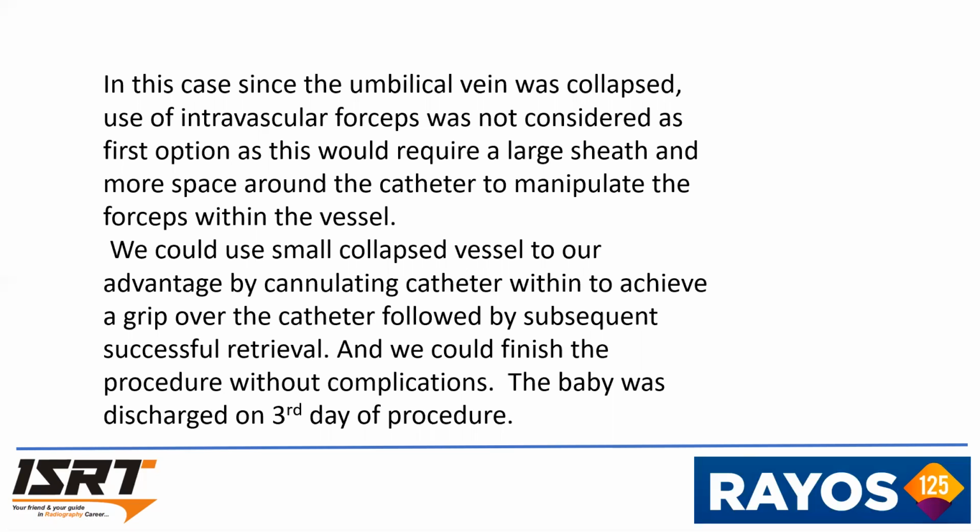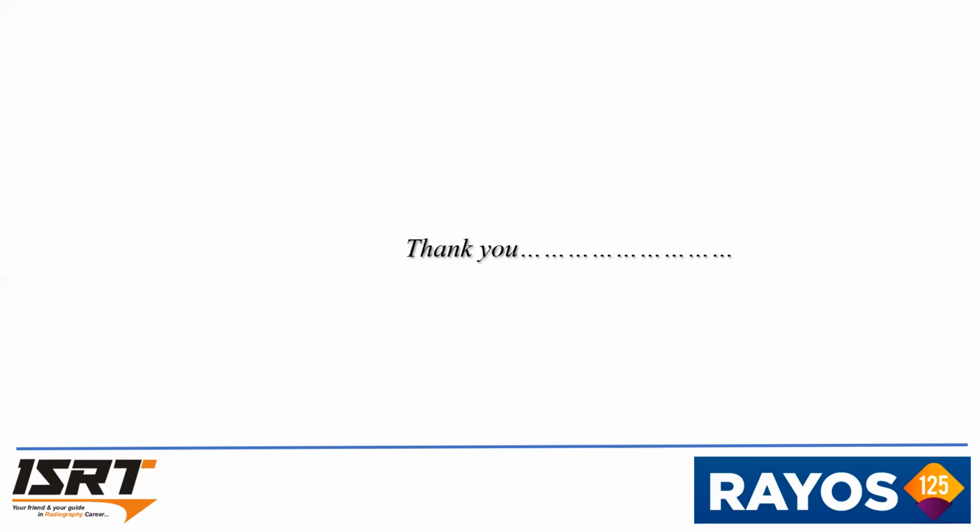And we could finish the procedure without any complications. Our radiologist and cardiologist and the neonatal team together could do the case without any complications. The baby was discharged on 3rd day of procedure.